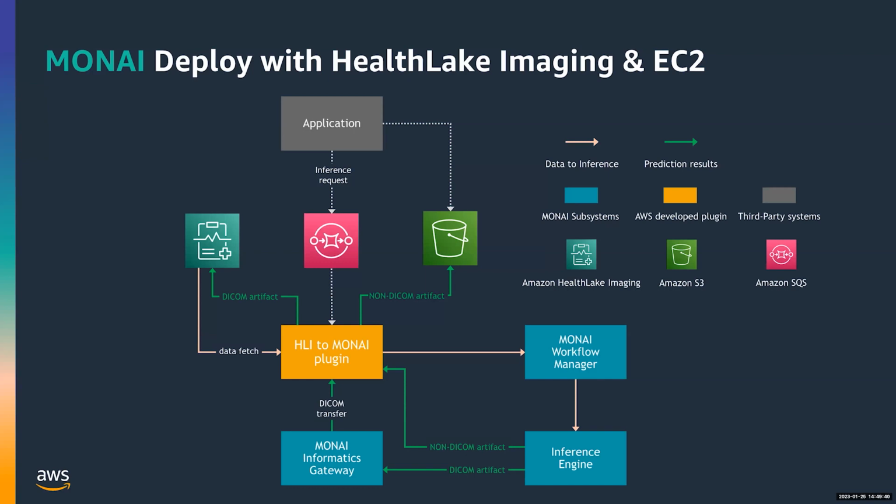And then you will also find an identifier that we call the workflow ID for the inference that we want to run. MONAI Deploy and MONAI Deploy Express, for that matter, have different ways to run. You could send the data into MONAI Deploy, and based on the DICOM metadata, MONAI Deploy will figure out by itself which workflow is best to run on that data. Or you could instruct MONAI Deploy to run a specific workflow if you want to. In that case, when I selected the breast density classification algorithm in the user interface, I told the plugin that that's the one workflow we want to run.